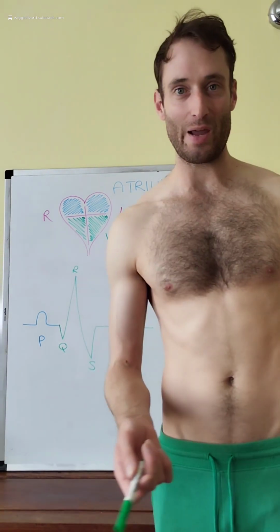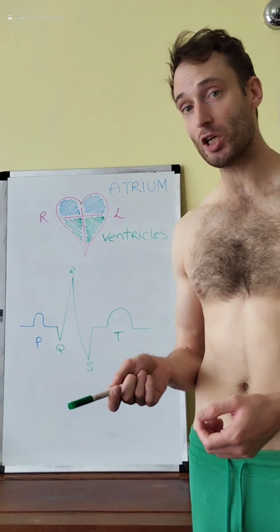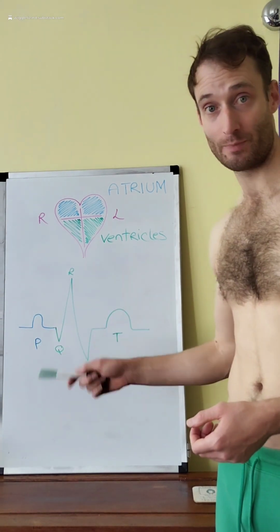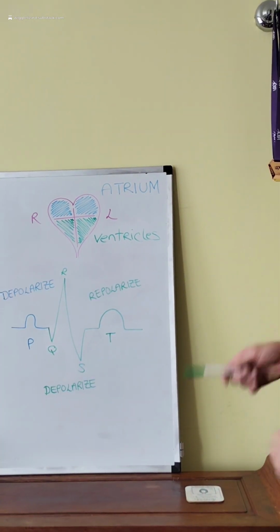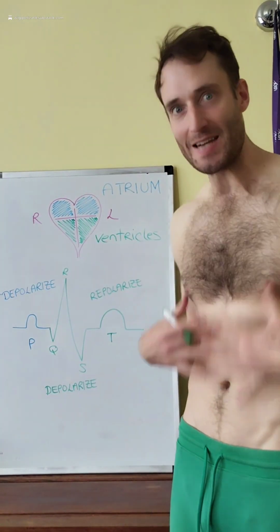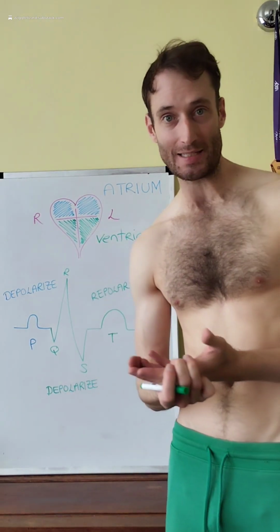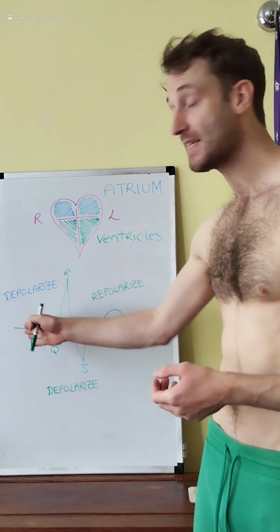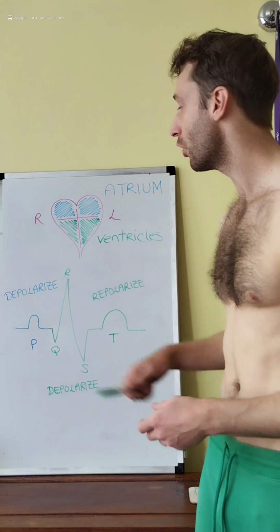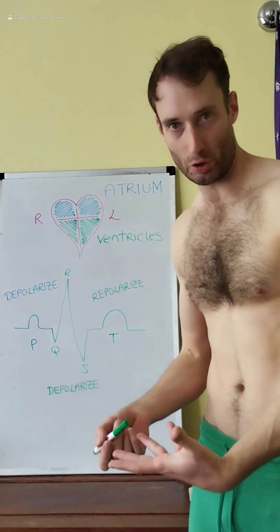The last thing I would say with this overview is that you'll hear the words depolarization and repolarization when they're talking about the waves. And this is because your heart, it's an electrical system. An electrical event is happening that causes the contractions and causes the relaxation and refilling. So what the ECG is actually reading is these electrical events. And so the depolarization of the atria results in a contraction.